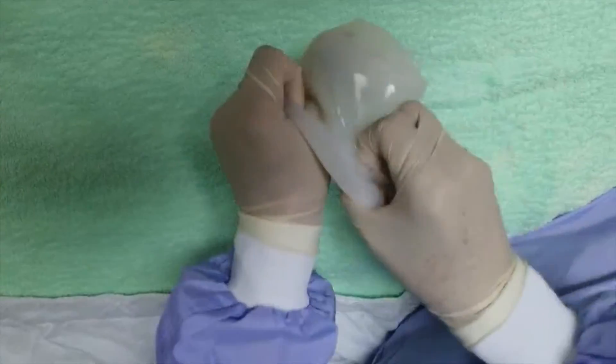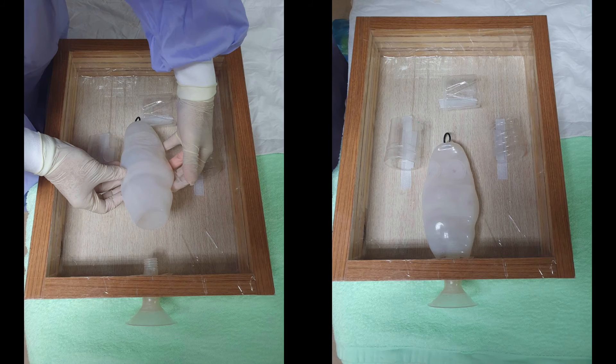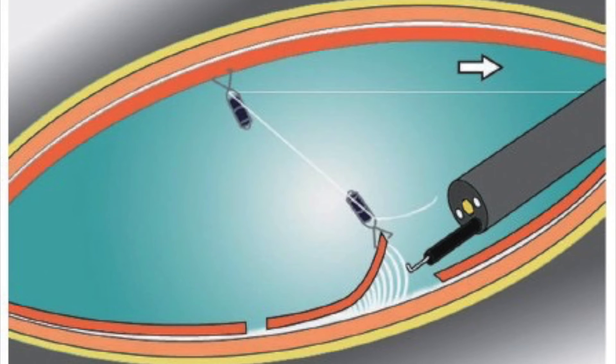Third, we turn it outside in again and then fix it on a self-made endoscopic training box with a silk tie. Now the model is ready for the traction method.